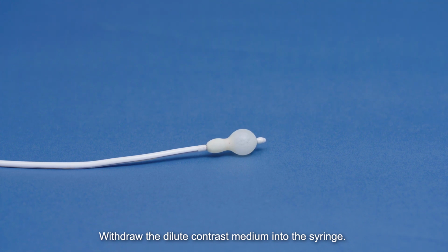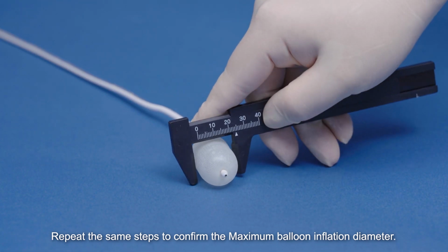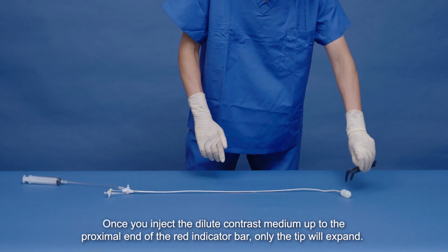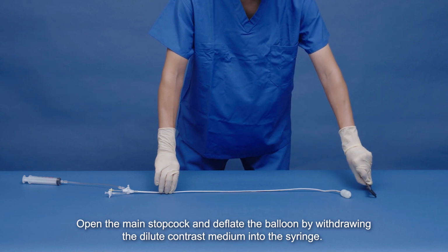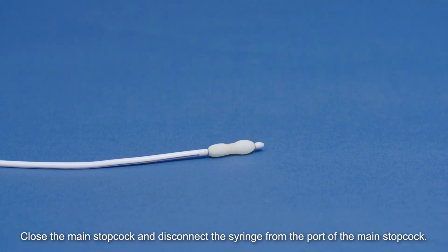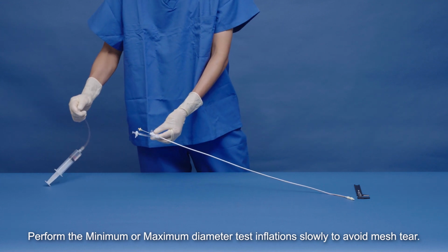Withdraw the dilute contrast medium into the syringe. Repeat the same steps to confirm the maximum balloon inflation diameter. Once you inject the dilute contrast medium up to the proximal end of the red indicator bar, only the tip will expand. Open the main stopcock and deflate the balloon by withdrawing the dilute contrast medium into the syringe. Close the main stopcock and disconnect the syringe from the port of the main stopcock. Perform the minimum or maximum diameter test inflations slowly to avoid mesh tear.